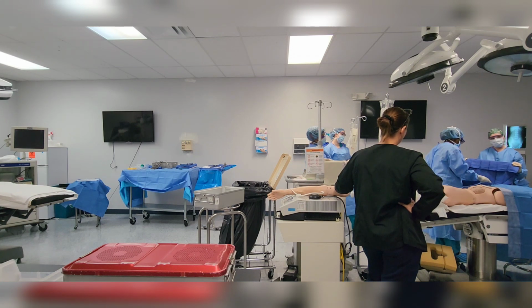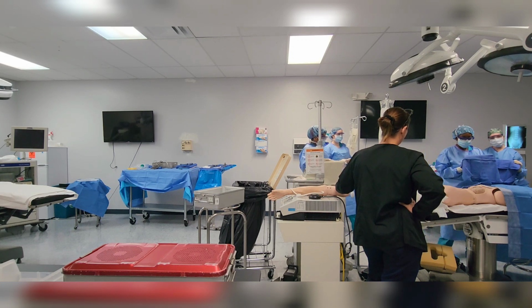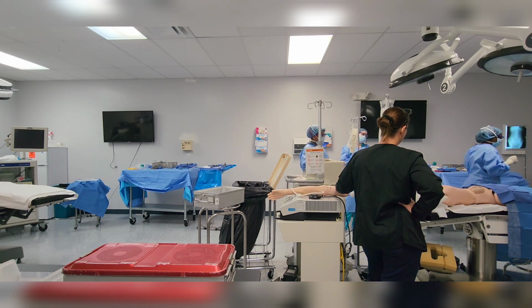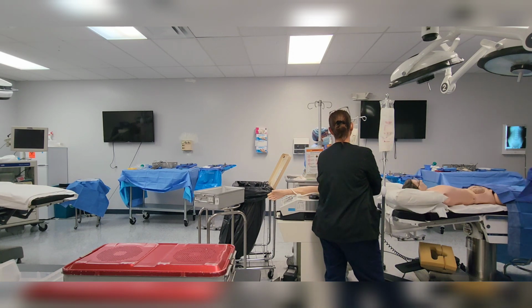Now, in the real world, a doctor is probably doing this as a student or some assist, but eventually you will do this. Some doctors will expect you to drape the patient before he comes in, and you will help with the preceptor. As a student, maybe in the beginning you won't, and some sites will frown upon you doing this, but some will let you do it, depending on where you're at.